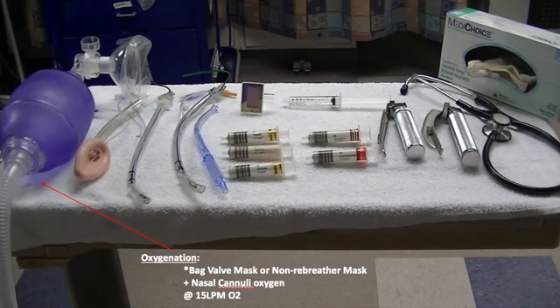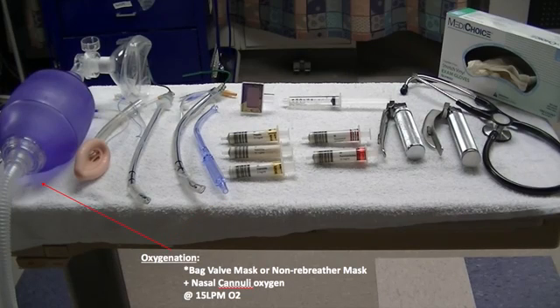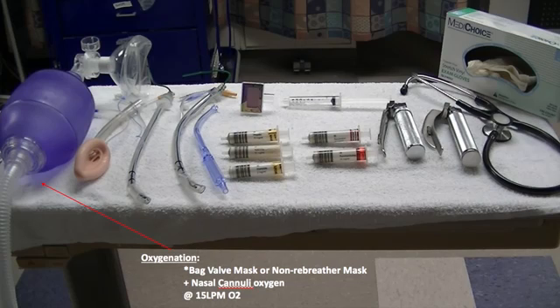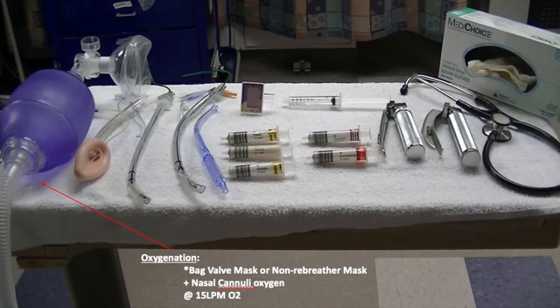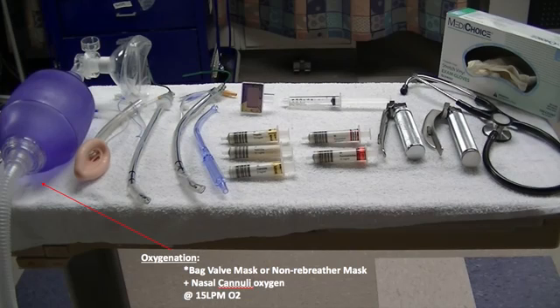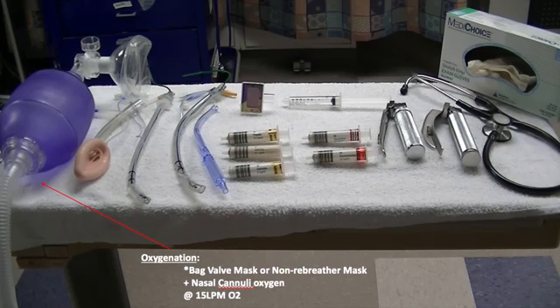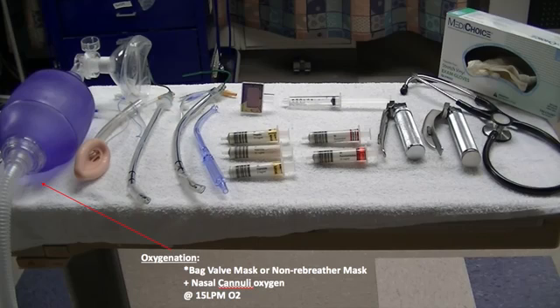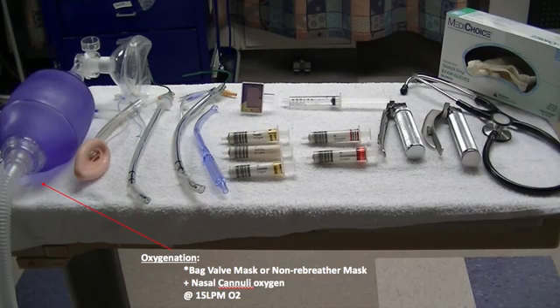Oxygenation. A critical step in intubation is to pre-oxygenate your patient. This allows your patient to maximize their oxygen saturation before you attempt to secure their airway. This is a bag valve mask. You should also place a nasal cannula on the patient with oxygen cranked to its maximum at 15 liters per minute, to maximize the pre-oxygenation step.